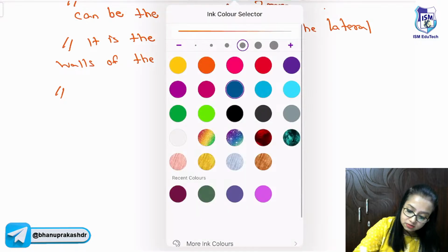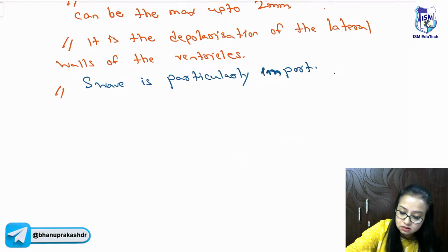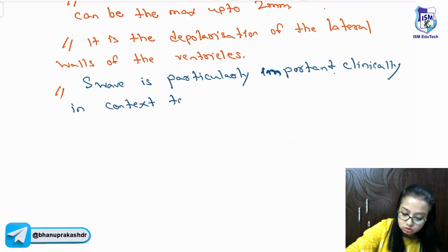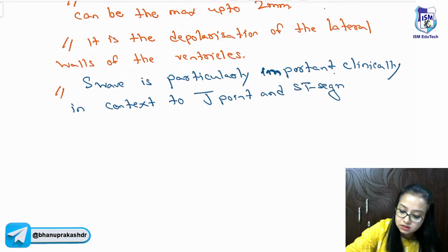This S wave is particularly important clinically in context to the J point and ST segment.